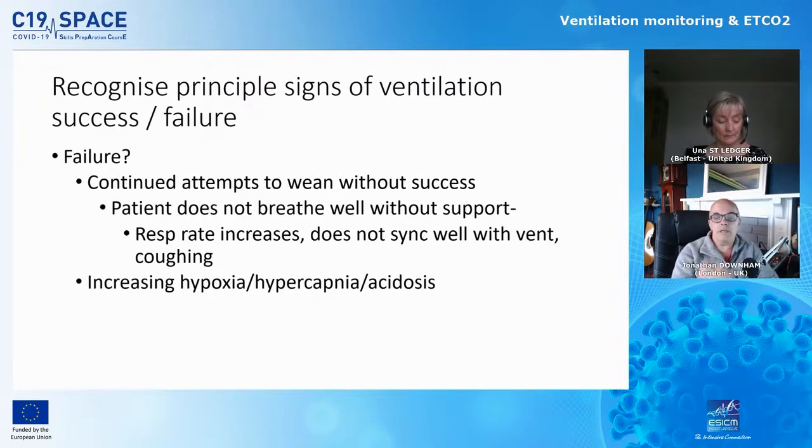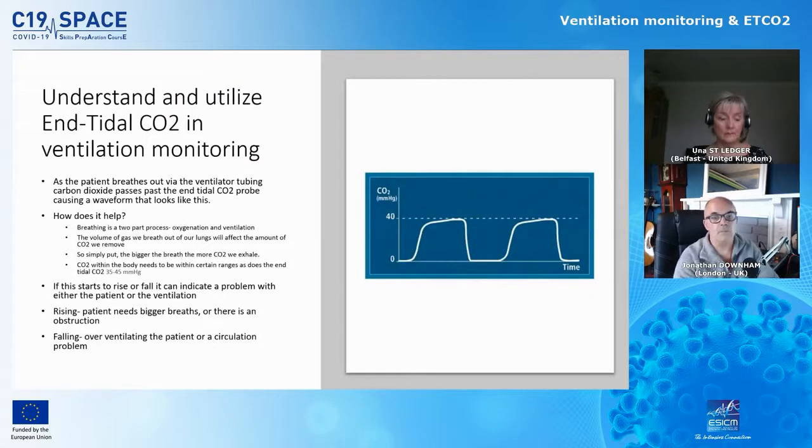So if the patient doesn't breathe well without support, if they don't sync well with the ventilator, or if the respiratory rate increases, that's a sign of failure as well. So that's the two sides of success and failure, and recognizing that is important to decide whether you're going to move forward or increase the amount of support that they're needing.